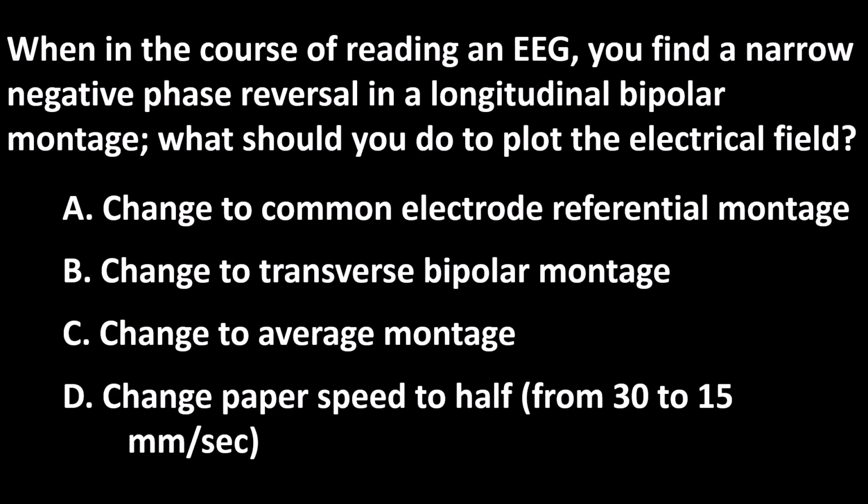Next question. When in the course of reading an EEG, you find a narrow negative phase reversal in a longitudinal bipolar montage, what should you do to plot the electrical field?